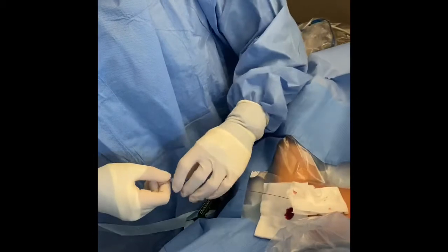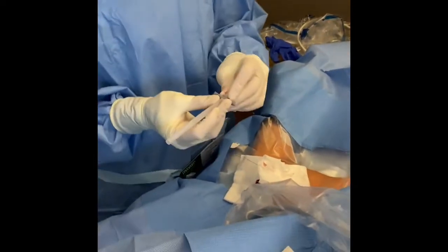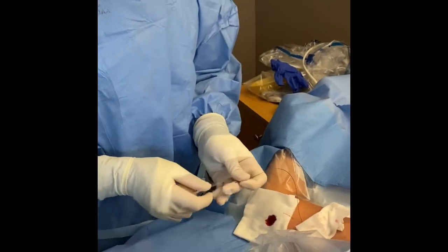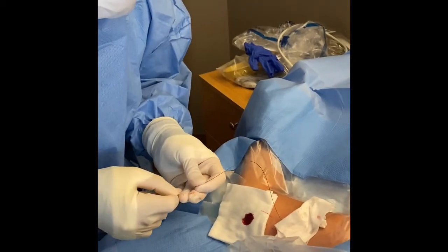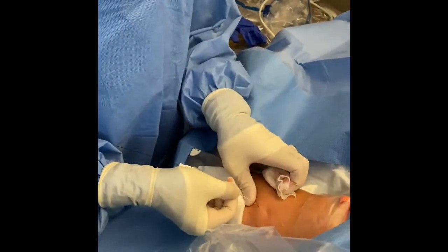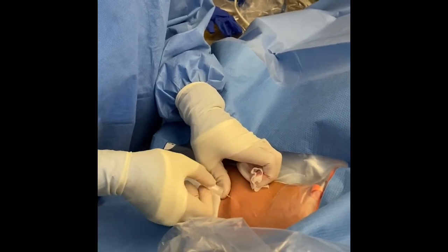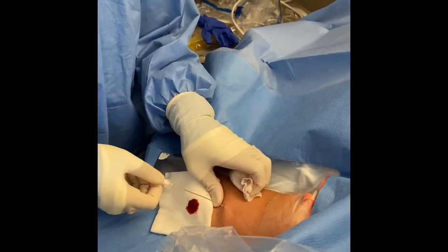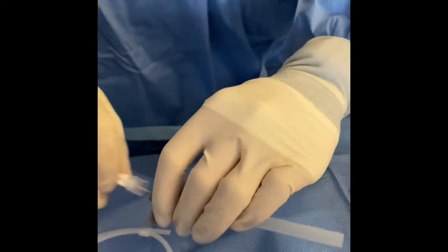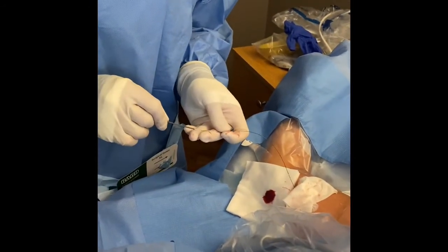Now remove the needle. You're going to feel a little pressure — not a lot of pressure, just a little pressure. You might need additional lidocaine if you want. If you don't feel it, you really don't need it — it's already numb. Now you would put it back to the microintroducer and stick it again with the microintroducer in it. The patient says she doesn't feel anything right now.